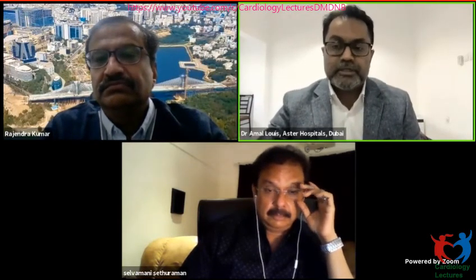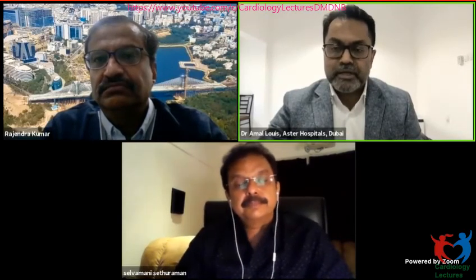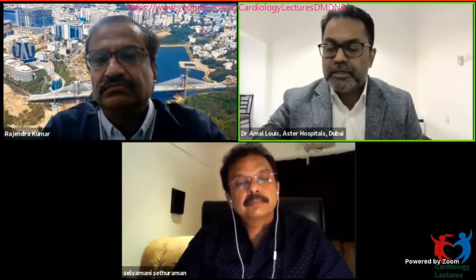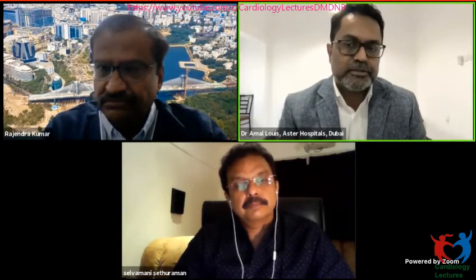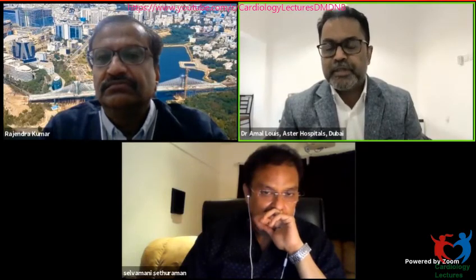One thing I noticed with the OPN, very valuable points Dr. Selmani mentioned about wires. When you're doing bifurcation, previously we all used 7 or 8 French, but nowadays with the profile of the balloons changing, I do a lot of bifurcation using 6 French. I think when you're using OPN, you need to make sure that you're not using a 6 French for bifurcations with 2 wires.